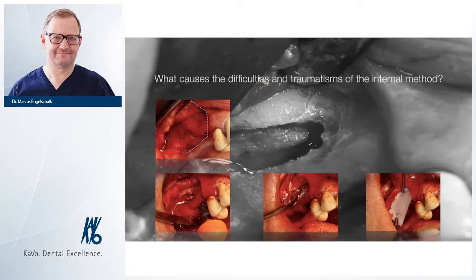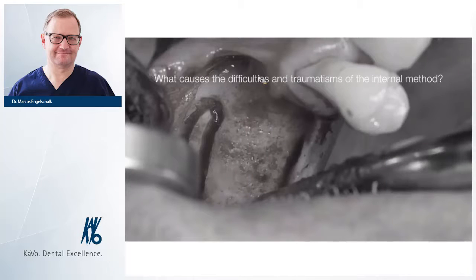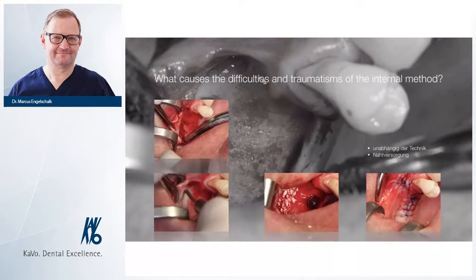Cracking is a little bit of a problem, and what we say for you is if you do the osteotome technique, then you have to tap on the instrument. And believe me, I have had an implant performed on myself with the osteotome technique. You will hear it through the whole head because it's a very strong noise you can recognize.